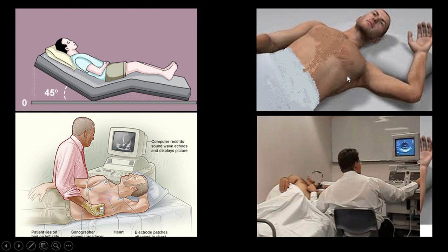As you know, especially when you work in the hospital, many patients cannot turn. They have some restriction for many reasons, like after an angiogram, a coronary angiogram. The patient for a few hours cannot turn to the left or right, or for any other reason, sometimes we have to scan the patient supine. In those cases, if the patient's situation lets us, we elevate the head side to 30 to 45 degrees. That may push the heart a little closer to the chest.